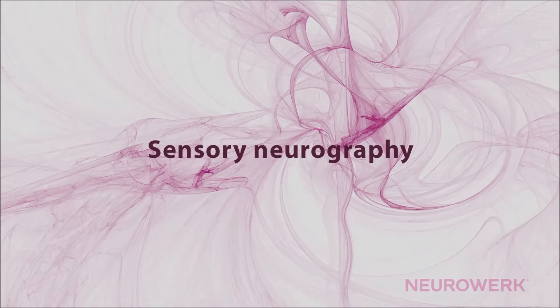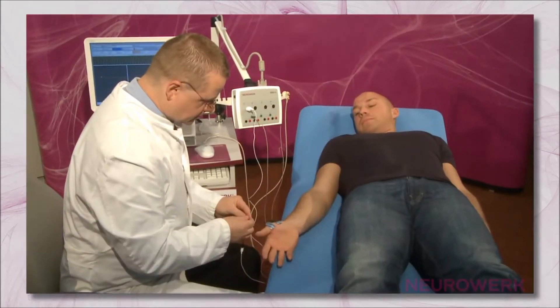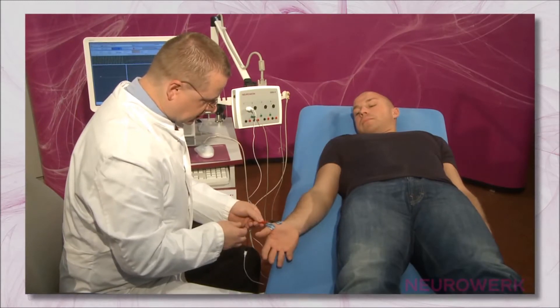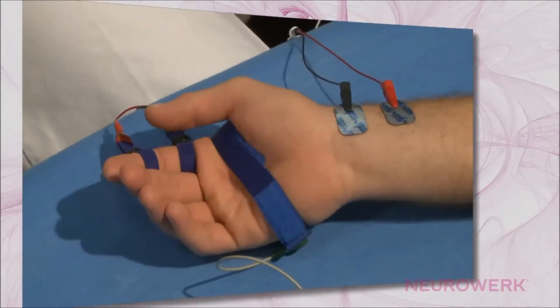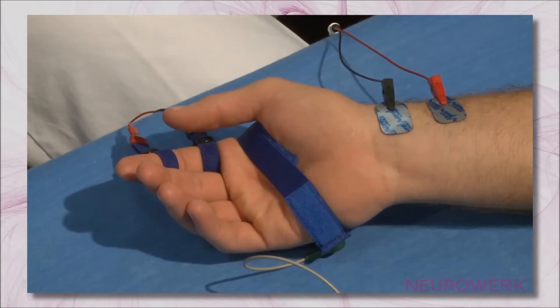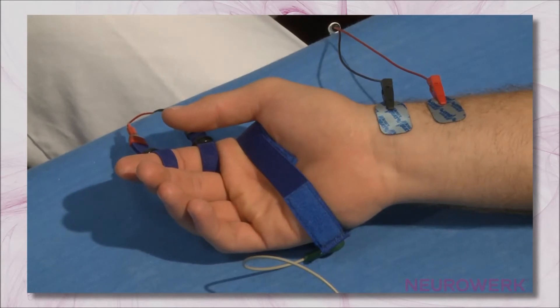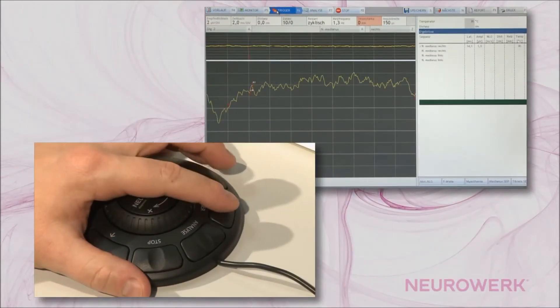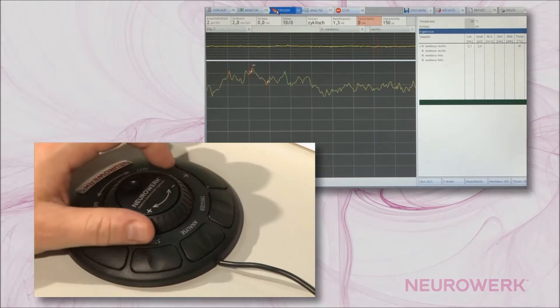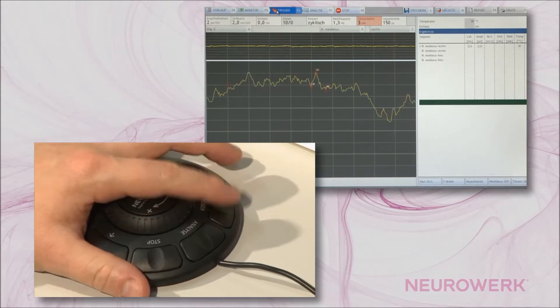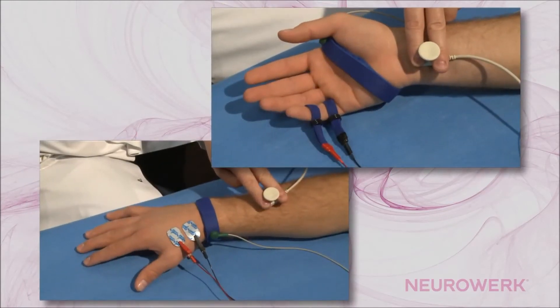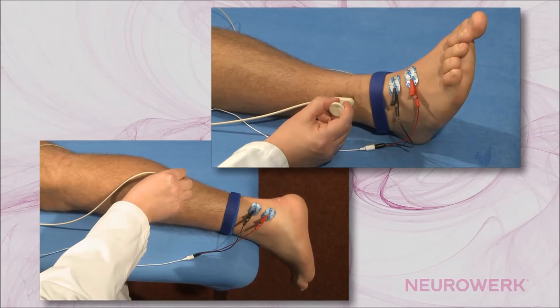Sensory Neurography. The implementation of sensory neurography is basically similar for all nerves available for this examination. It is recommended that this examination be viewed using the example of the median nerve. The techniques shown and described herein are essentially repeated in all other nerves, particularly regarding the basic application of stimulation and recording electrodes and the method of distance measurement.